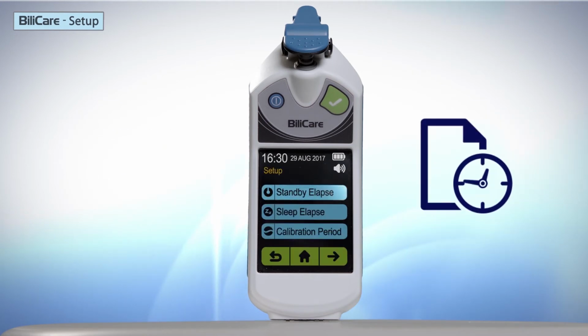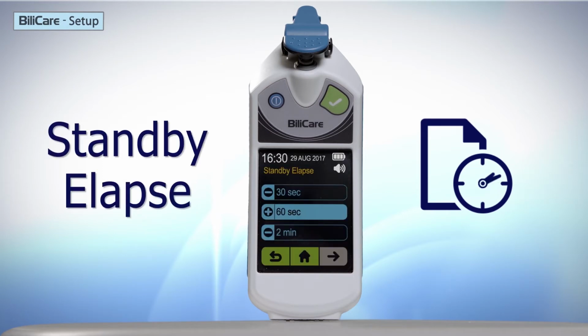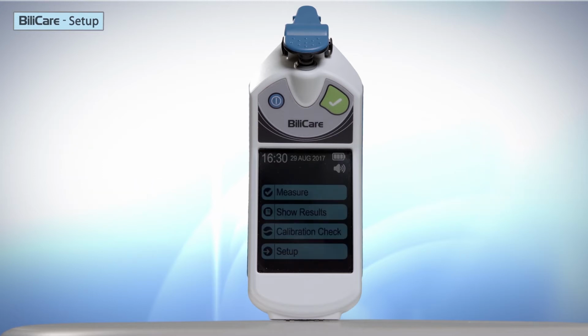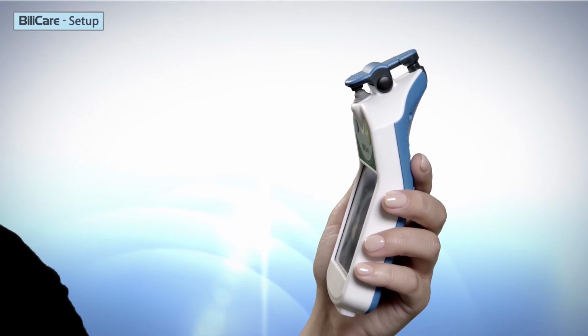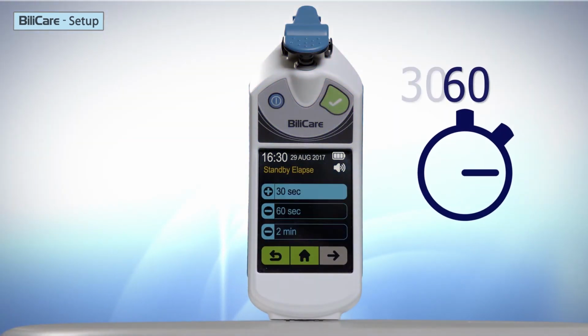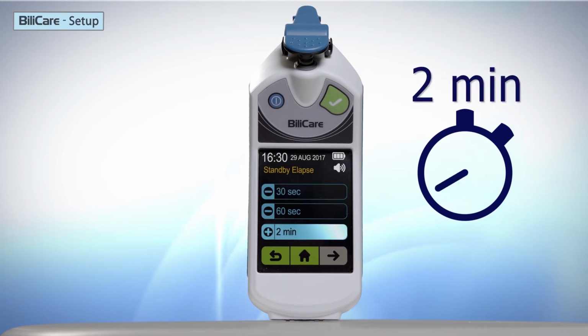The Standby Elapse menu determines the elapse time from the last screen touch. At the end of the elapsed time, BiliCare displays the home screen at reduced brightness. Any touch on the screen resets the elapse. The default time is 60 seconds. 30 seconds or 2 minutes may be selected.